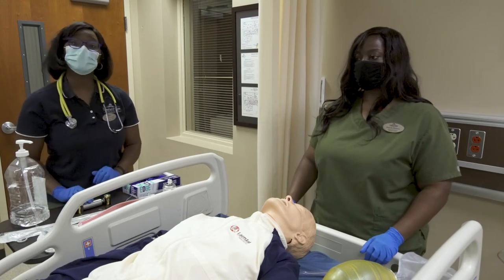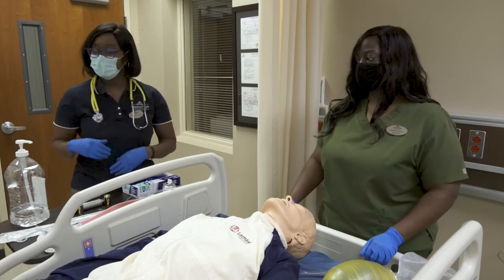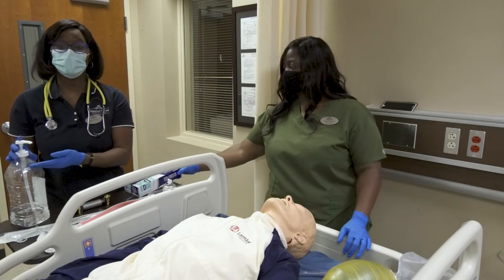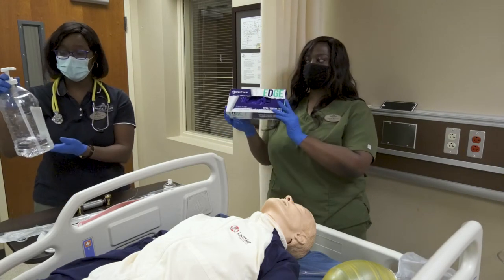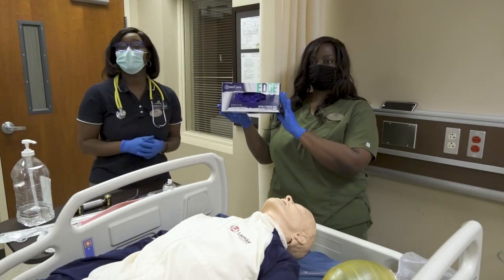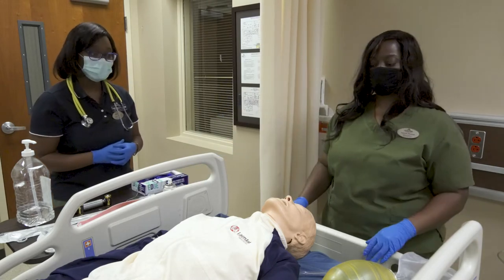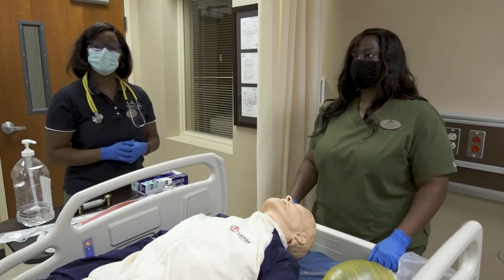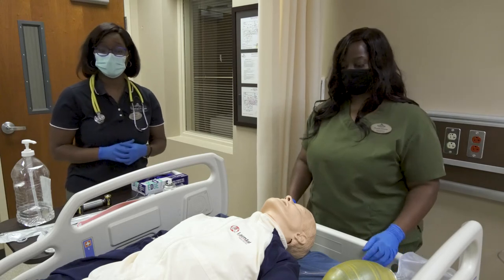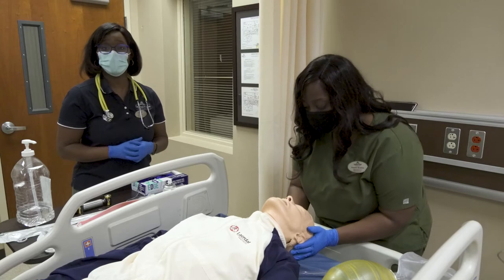Before you begin your procedure, make sure you use standard precautions. You want to clean your hands with soap and water or your alcohol-based hand sanitizer. You want to make sure you have on a pair of gloves and face shields if needed.